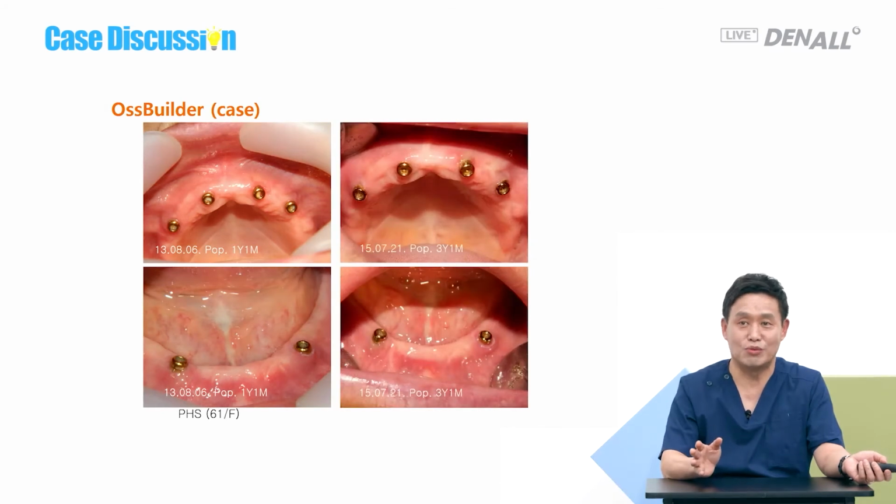After 3 years, only allogenic bone was used, so it is resorbed, but the patient is satisfied. Compared to the previous denture, this is much better. So she's happy. She didn't want a denture from the start, but even hybrid cannot provide the lip support. Even with the GBR, the lip support could not be achieved. That's why we did it like this.